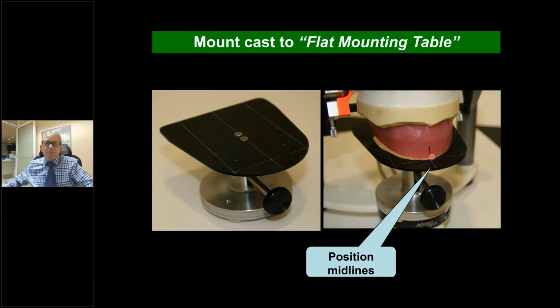We're going to line up the labial part with our line here. The midline is going to line up here, and that's the one thing I forgot to tell you. You look at the lines that we put on there for you. If that line is straight there and it's not quite in the middle, then you just scribe a new line to the left or to the right of it. If it needs to go left, you go to the left and you do a little bitty line.